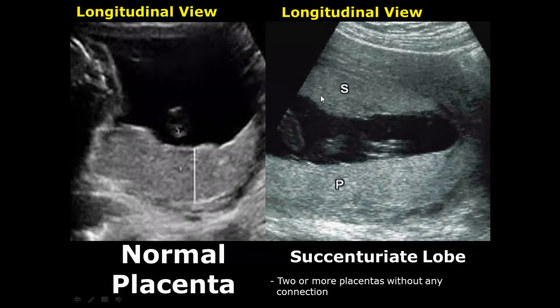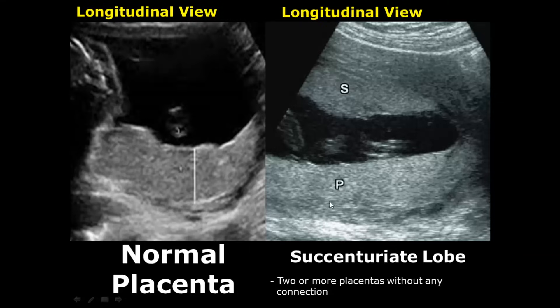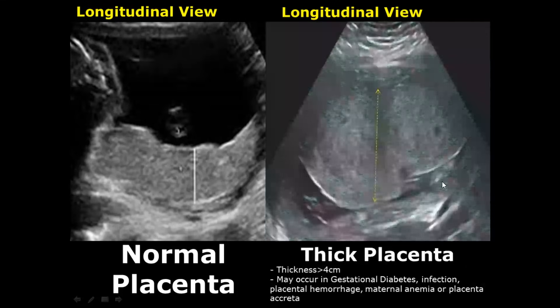A succenturiate lobe is an accessory placental lobe present in addition to the main placental lobe. Here we see the main placenta and an accessory placental lobe — the succenturiate lobe — without any connection between the two.